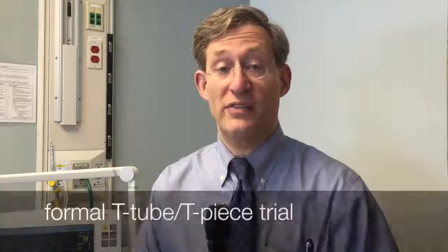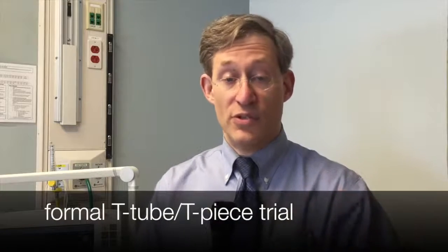The first is a formal T-tube trial. This is the oldest way of doing a spontaneous breathing trial, in which you coordinate with the respiratory therapist and politely ask them if they could disconnect the patient from the ventilator, and they put corrugated tubing, and the patient breathes on their own. One might say, well, what about the work of breathing of the endotracheal tube itself? And there have been studies looking at this, and the basic idea is if the patient can't tolerate a T-tube trial, they may have difficulty being extubated.